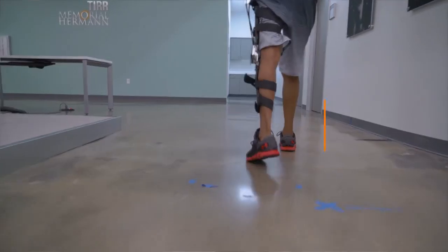They have to tell us what they need. They have to tell us what they want so that when we finalize the soft exoskeleton, it is something that will be useful, meaningful, and something that will help them in their recovery and their activities of daily living.